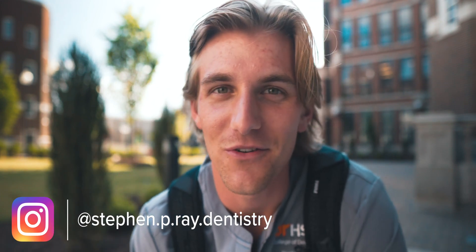What is up everyone — my name is Steven and I am a first-year dental student about to be a second-year dental student. I realized I had never done any tutorial on the actual lab work we do here in dental school. I'm at the University of Tennessee Health Science Center and I'm going to take you inside the lab to show you how I cut a class 2 preparation on an upper tooth — a simple amalgam preparation. I'll show you all the tools I use and tips and tricks for cutting these preps as close to perfection as possible.